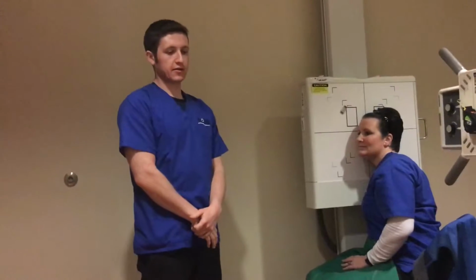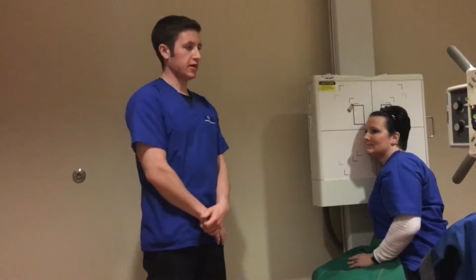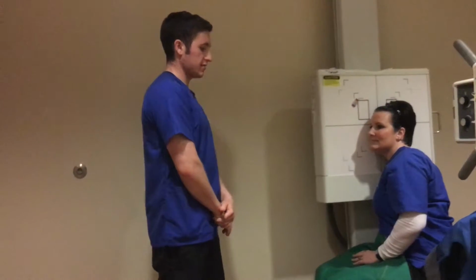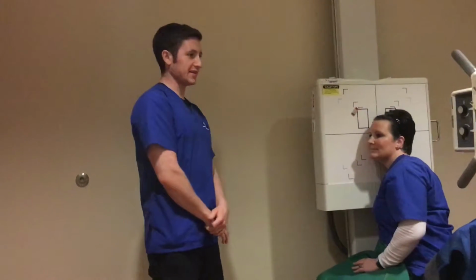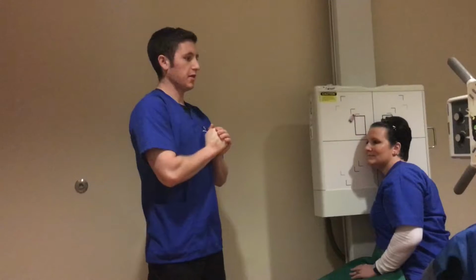The radiographic pathology that I will be screening for today is Paget's disease of the bone. The two projections I will be doing are the lateral skull projection and the AP pelvis projection. Before I do these, I'm going to identify my patient, ascertain any probability of pregnancy, take an accurate history, and prepare my patient by removing any artifacts such as earrings, glasses, or pants that might have metal zippers or buttons.